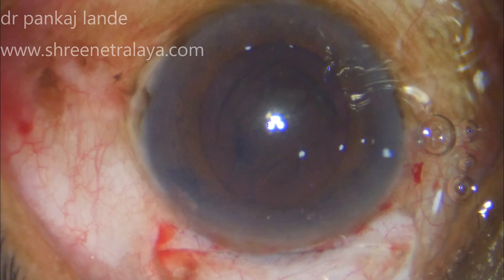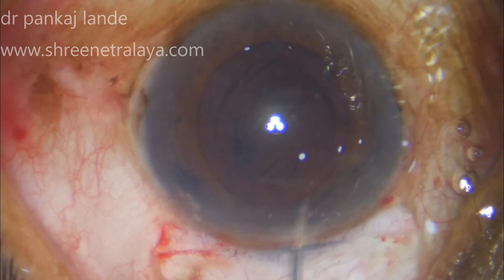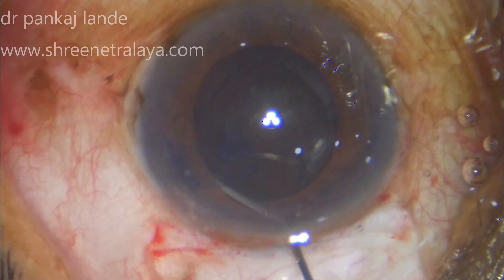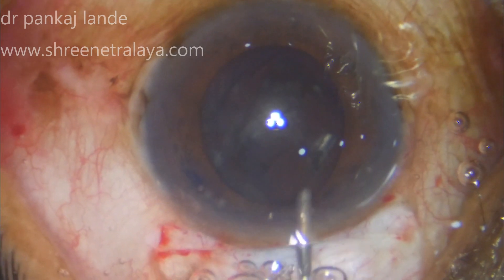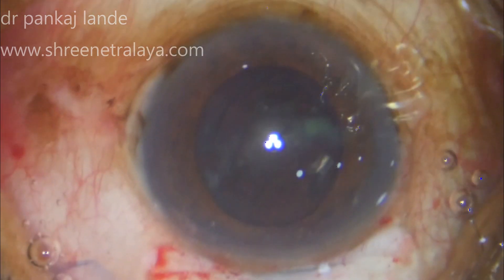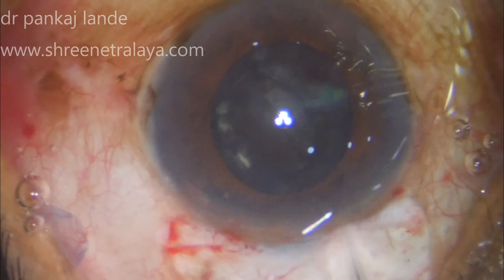Always take into consideration the size of the nucleus you are dealing with, so that you can have enough length of scleral tunnel to express the nucleus out without any hassle. Hydrodissection is done with the help of a 27-gauge cannula and the nucleus is rotated in the bag with the help of a dialer. Once the nucleus is freely mobile in the bag, it is time to take it out.